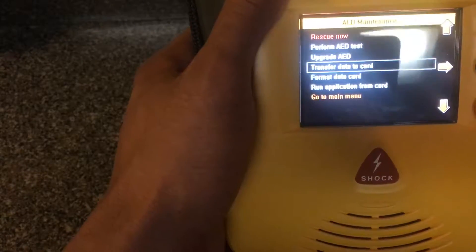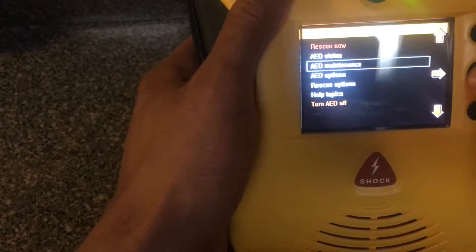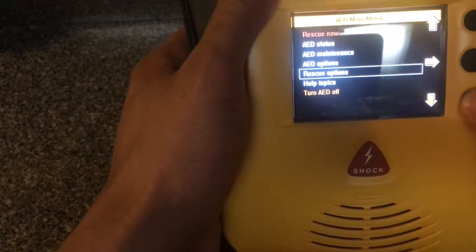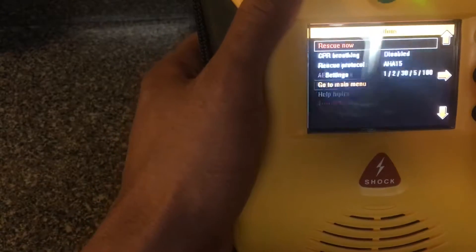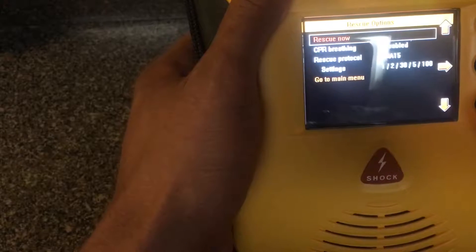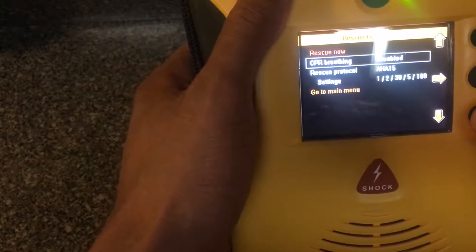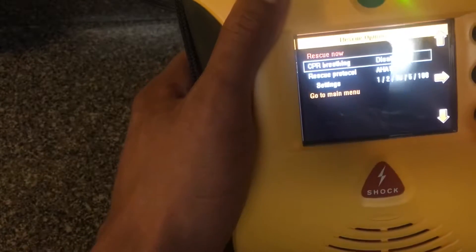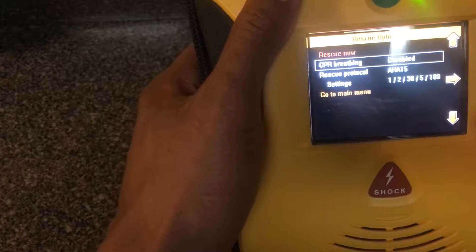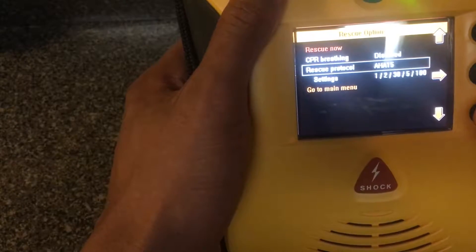So that's some of the controls with AED maintenance. Then you have to go back to main menu. You see that, and then you have rescue options. Okay, rescue options: you have CPR breathing. Of course that comes by default on this defibrillator as disabled.